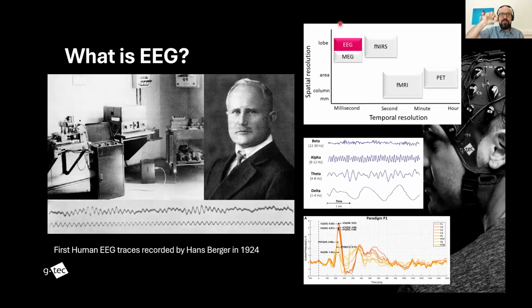So what you will be recording is a couple of centimeters around the area where the EEG electrode is placed. This is much better if you use ECoG. If you implant grids inside, you get rid of the hair, the scalp, and the bones, and you have the electrodes exactly on top. And obviously then the spatial resolution will be better for ECoG compared to EEG.